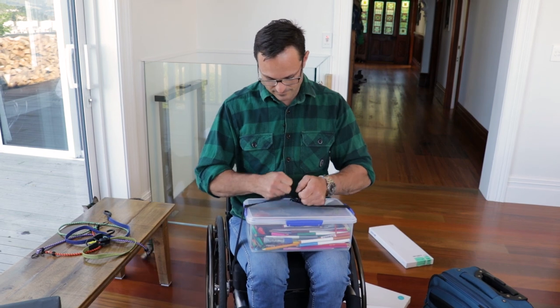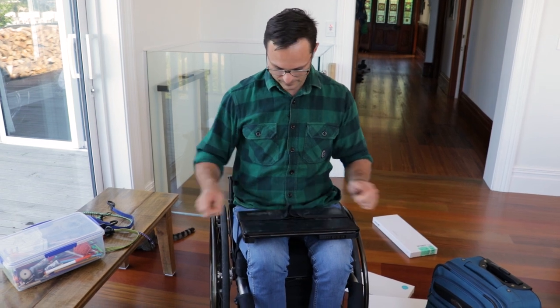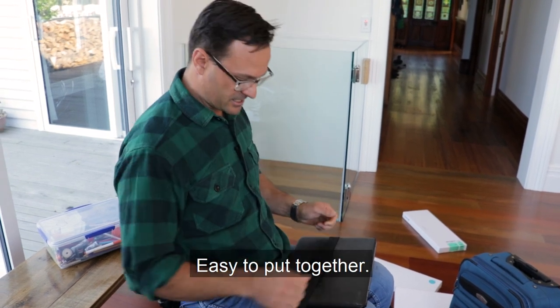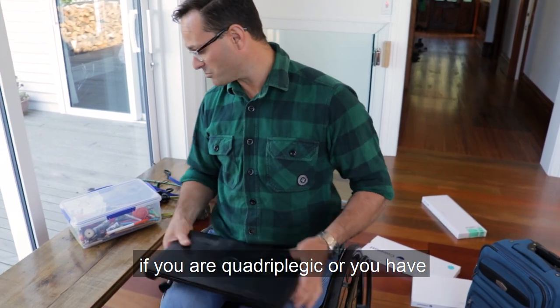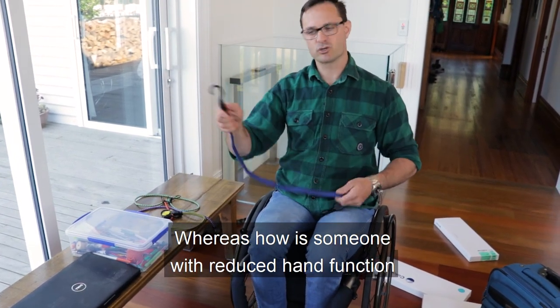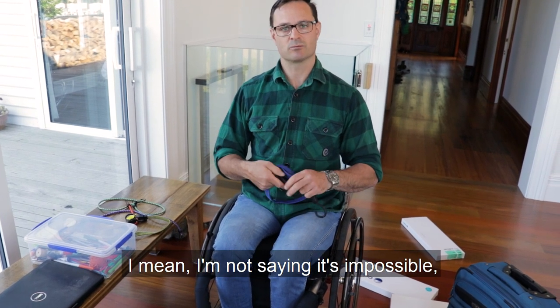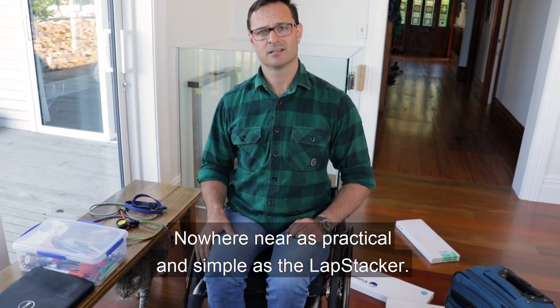Done. Laptop — no problem. Done. Different lengths, self-locking, easy to put together, easy to use with your fingers — even if you're quadriplegic or you have reduced hand function of some sort. Whereas how is someone with reduced hand function going to attach a bungee onto their chair? I'm not saying it's impossible, but certainly a lot more difficult — nowhere near as practical and simple as the lap stacker.